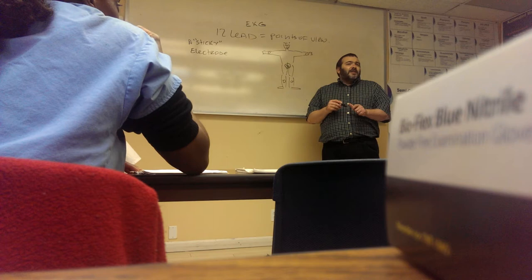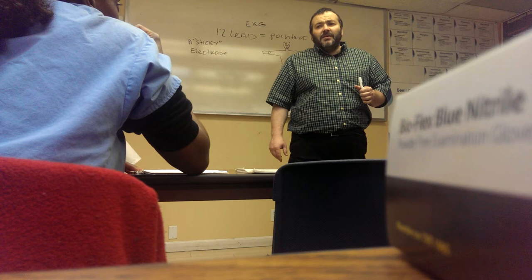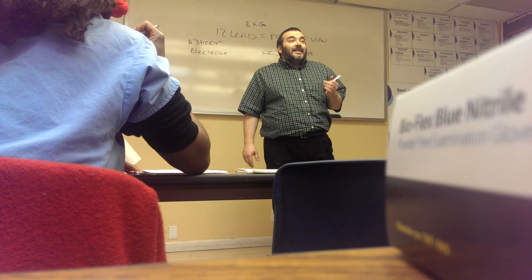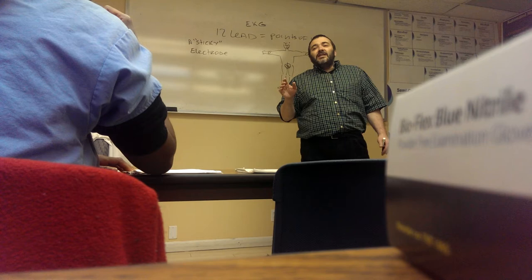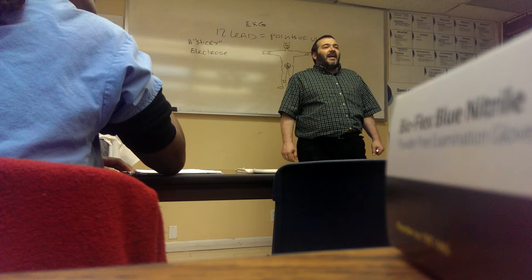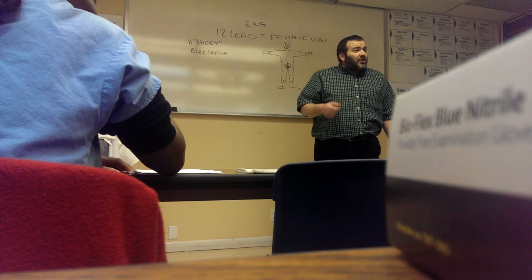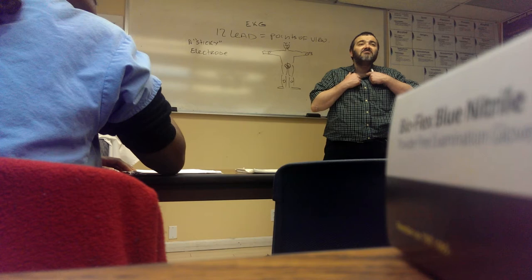If you're working in the emergency department, ED for short, all right? Used to be called ER, now it's the emergency department. It really is an emergency department. But in any case, there they have these stickies that you would need a jackhammer to get them off of a person's body because they have to stick no matter what. The stickies that we use over here, if a person is sick and they're sweaty, they're just going to come right off. You will never be able to do an EKG on them. And sometimes they use little suction cups. Sometimes they use the clamps on people. Sometimes when a hairy beast like me, right, comes in, you need to do a little shaving.